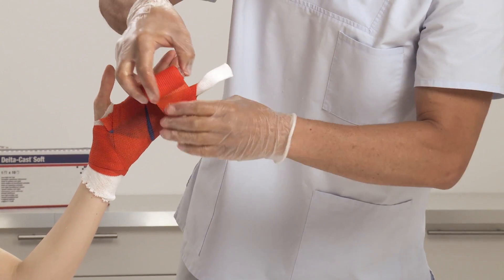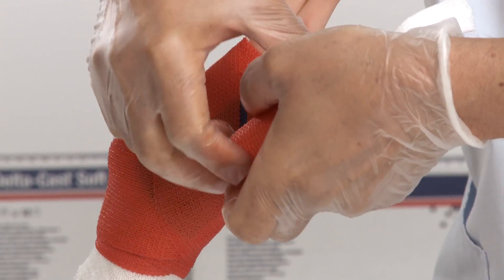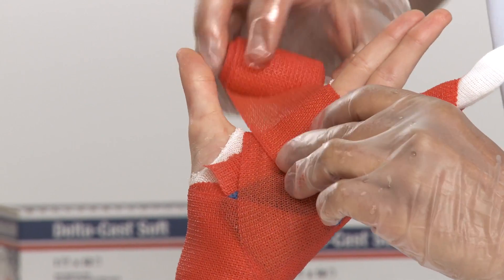Make sure to catch the ends below. Move back towards the palm, apply with 50% overlap, and cut.